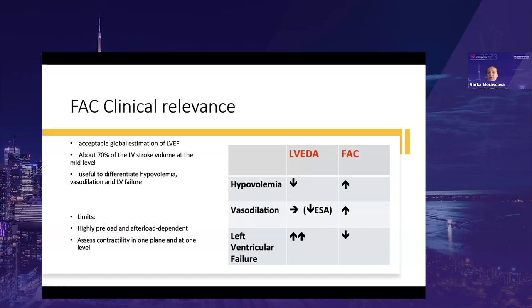But in the perioperative setting, it's useful because it's very quick to perform and easy, and it can give us scenarios for different clinical hemodynamic scenarios and evaluation of the status.